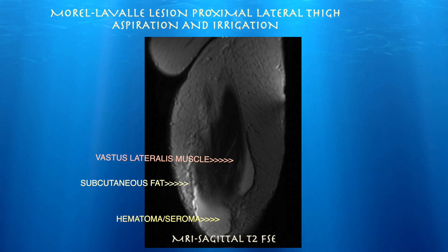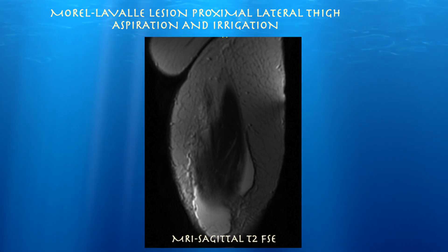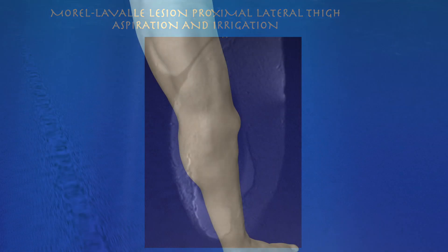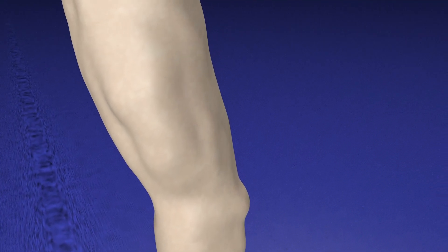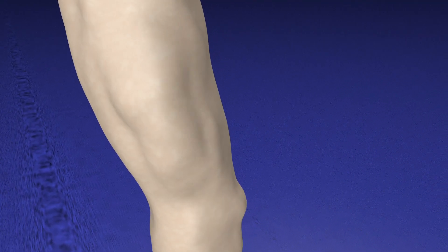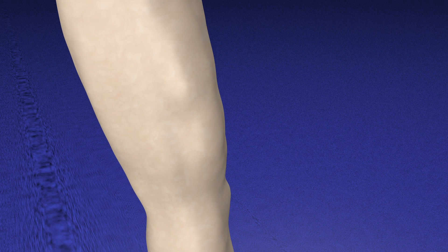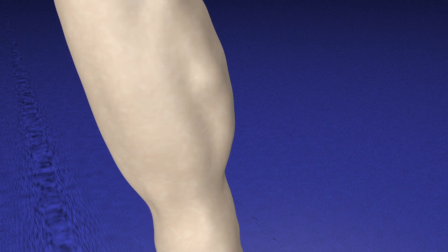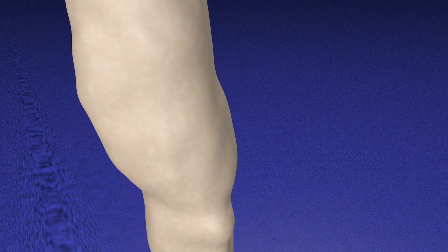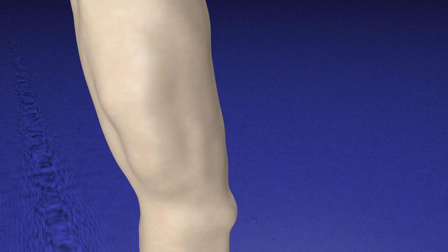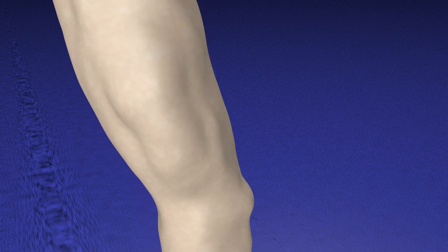Here's a sagittal view where you can see the lesion basically right over the vastus lateralis muscle. This patient has a very large fluid collection in the lateral thigh, essentially just bulging out from the lateral thigh. You can imagine how much fluid can accumulate in a space this large.